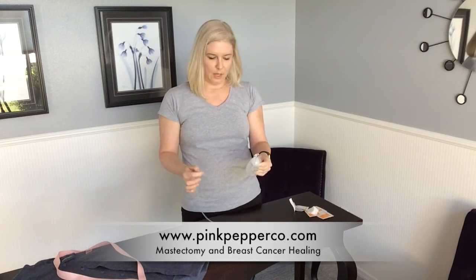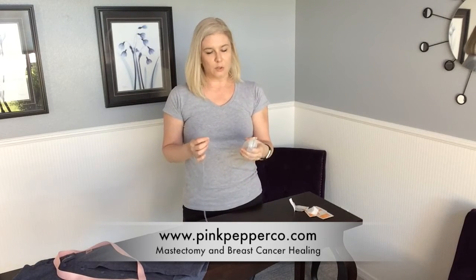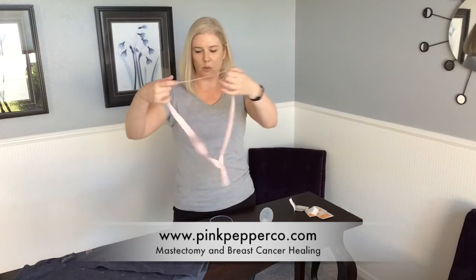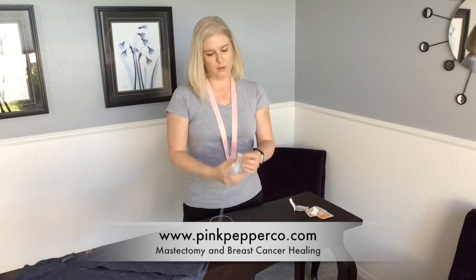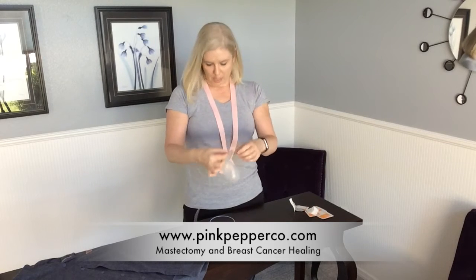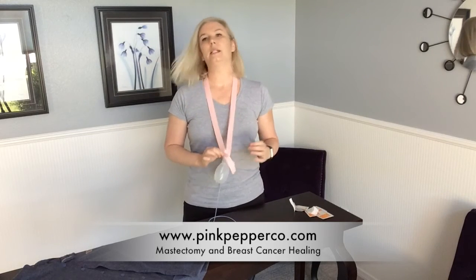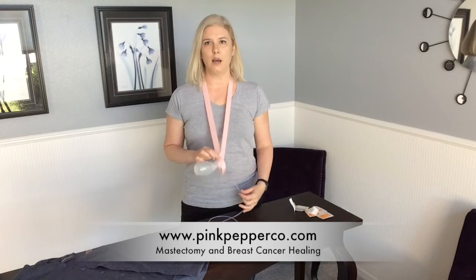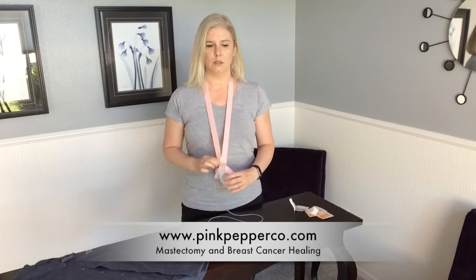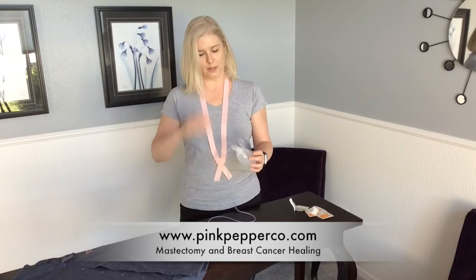One of the other things that's a little difficult with the drain is when you shower. Some doctors will say you can't shower. If you can shower with the drain, one of the things I used was just this little ribbon, just like this, and all the drains have some sort of little attachment here. You can just pin it, and then you can pin it to this so that in the shower it's not flowing all around. You want to keep it in control here.